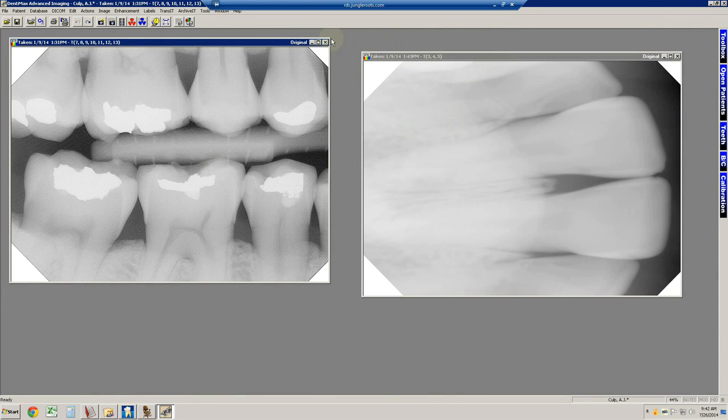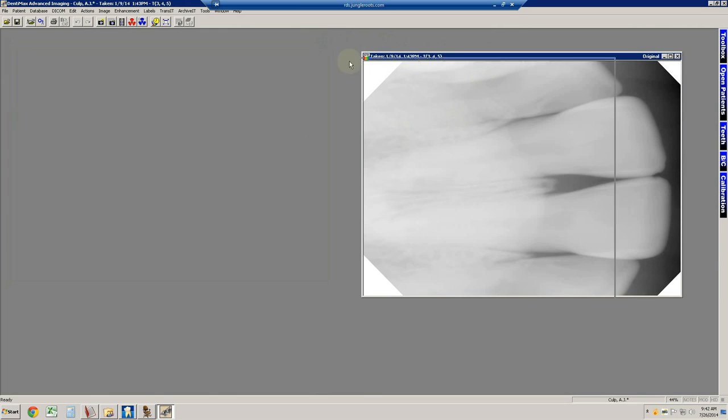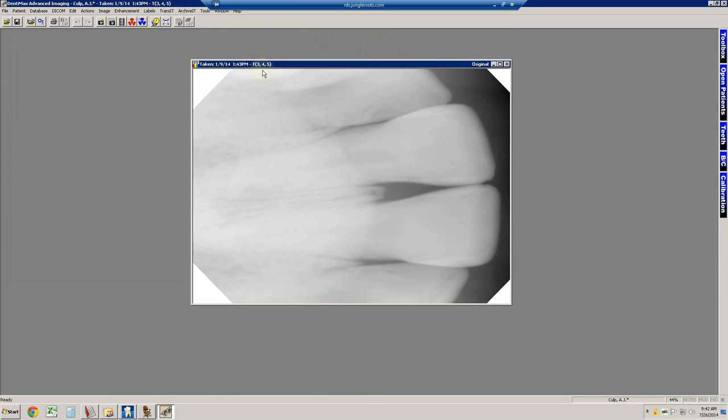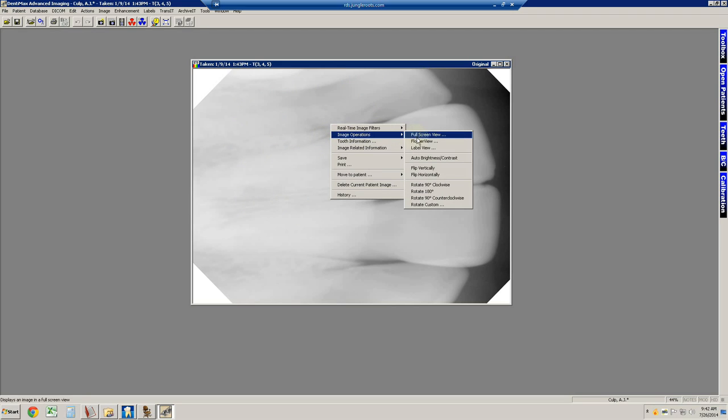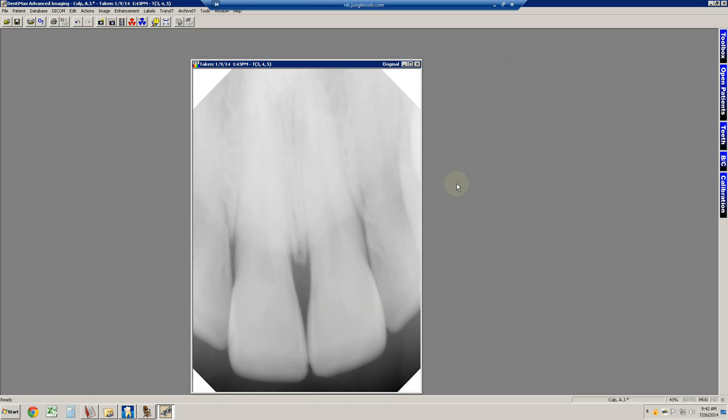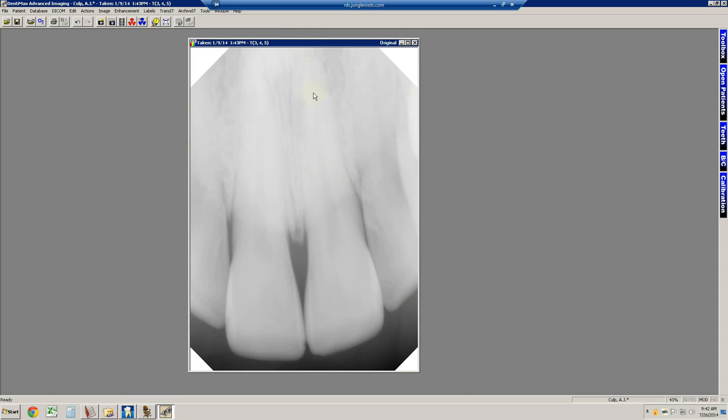Let's close this. This is the upper anterior front teeth, and they typically are not presented in this way. This image would need to be rotated 90 degrees in a clockwise rotation. We can do that very easily by right mouse clicking, selecting image operations, and rotate image 90 degrees clockwise. And when we do that, this is the appropriate view. It's important to have that oriented in that fashion because it just makes it that much easier to take a look at instead of having additional time necessary at the chair for Dr. Culp to do it. We're going to close this first of all, and we're going to save it.